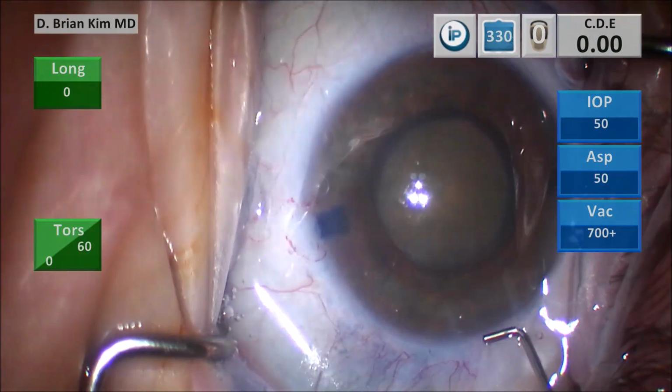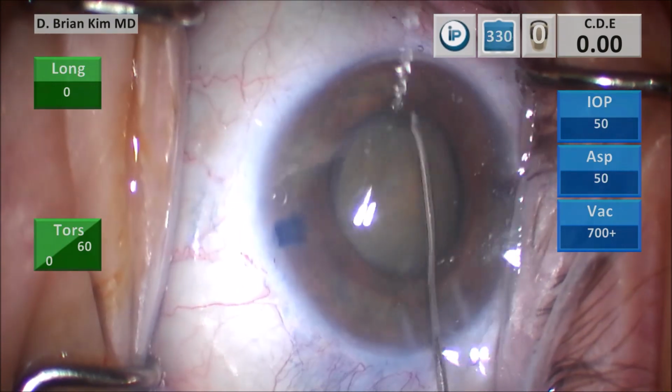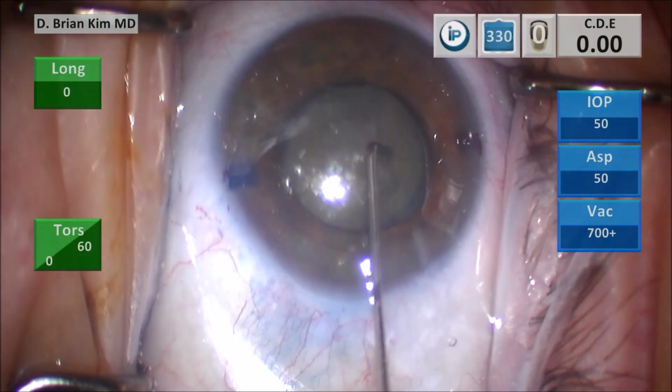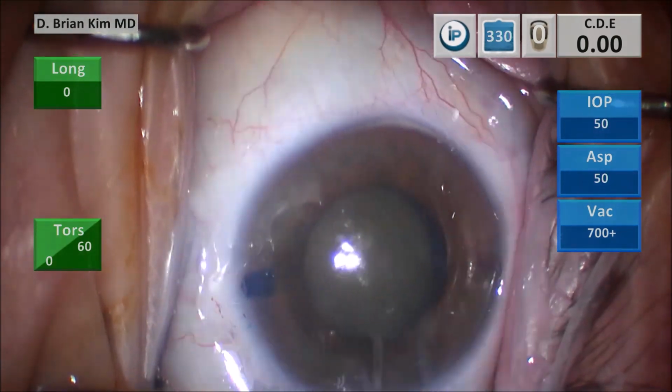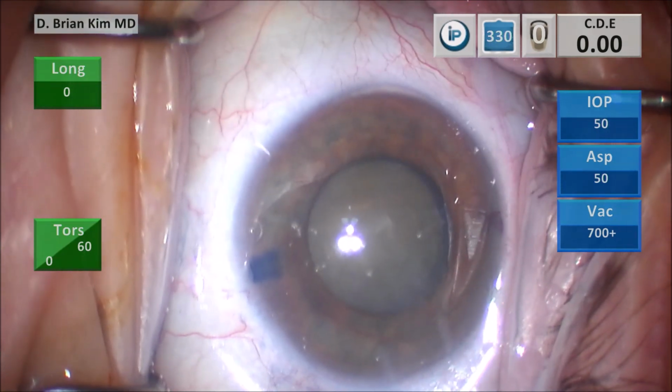I place a cannula out underneath the rhexis edge, contra-incisionally, point the tip down, push. I don't really see a wave because it's such a dense lens, but I see the lens rise. I decompress on the left side. I turn the cannula to the right, and you can see the lens spun pretty nicely there.